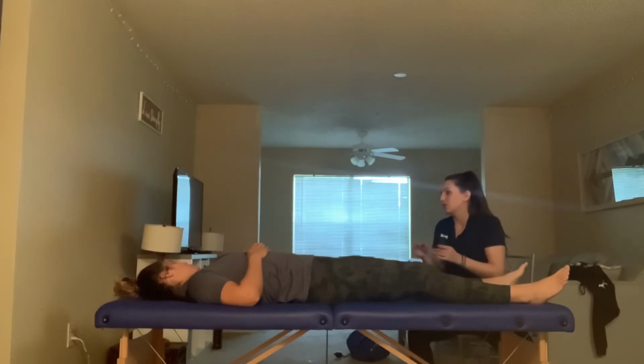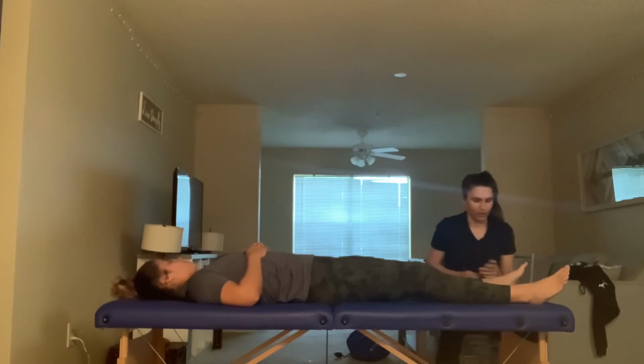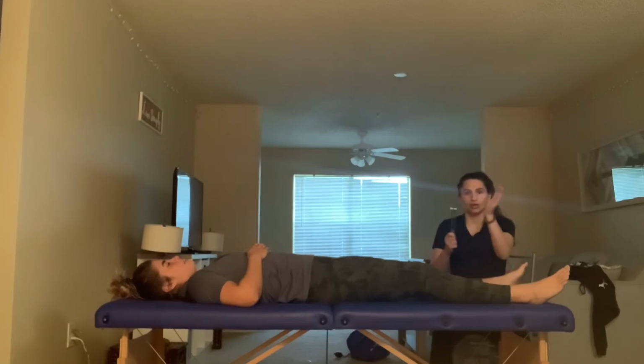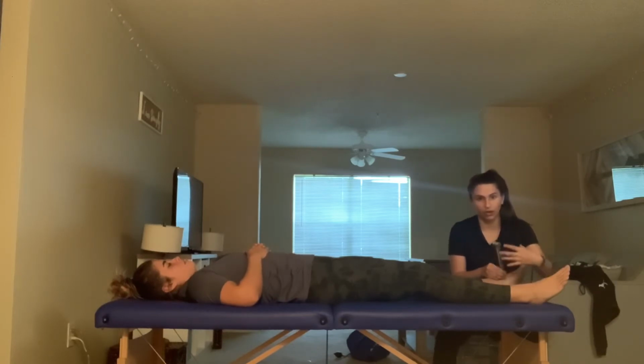In this video, we will be demonstrating a tuning fork screen for the navicular. Plain films are known to commonly miss fractures in the tarsals and carpals. To locate the navicular, find the medial malleolus and drop down towards the toes until the next most prominent bony surface is felt. This will be your navicular. Apply the steps mentioned above. Locate the navicular bone, hit the tuning fork, hold by the stem, do not obstruct the actual fork, and then firmly place the stem onto the navicular.